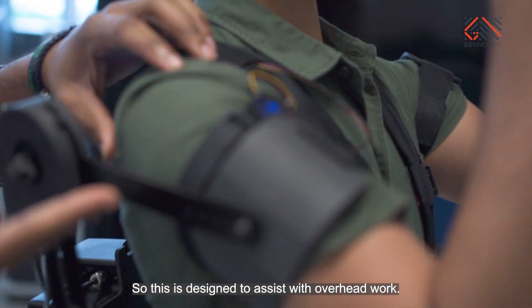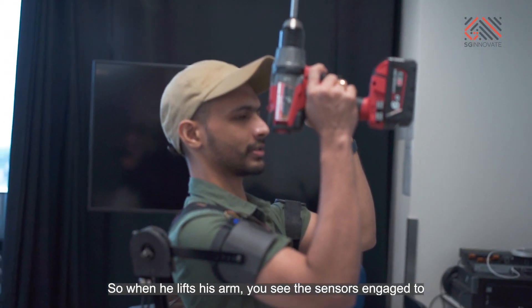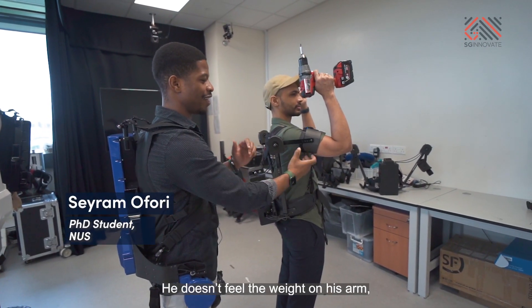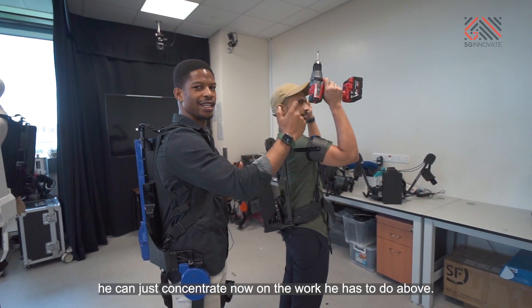This is designed to assist with overhead work. When he lifts his arm, you see the sensors engage to give him support. It feels like he's just resting his arm on a supporting base. He feels no weight of his arm and can concentrate on the work he has to do above.